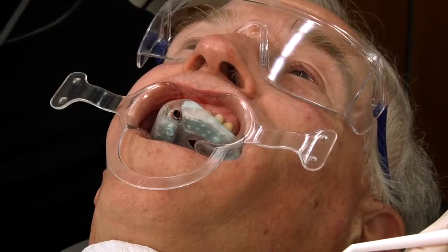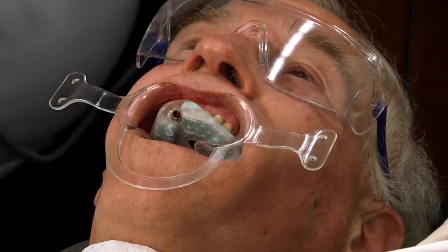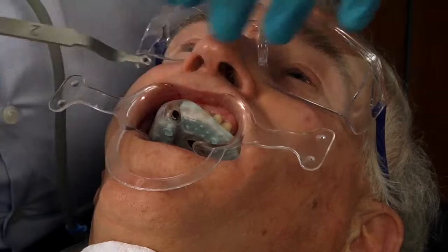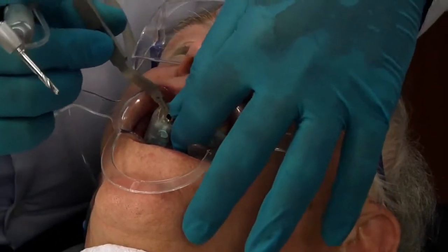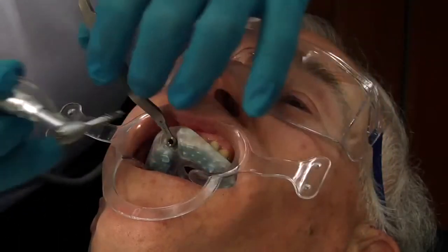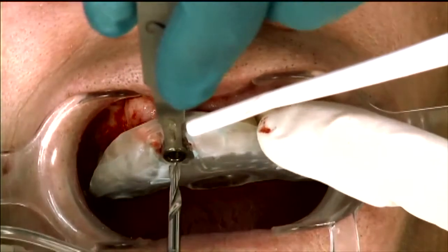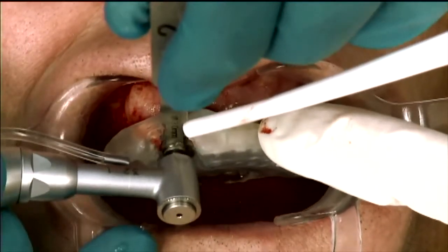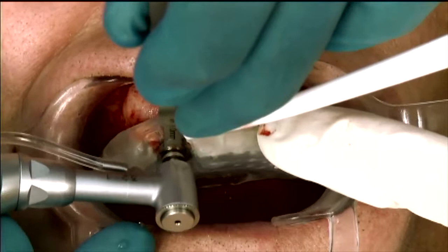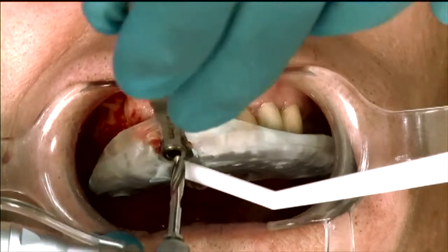The next handle says 3.0 C with handle number 2. So I'm going to bring in handle number 2 — there's the 3.0 end. It's going to go into the master cylinder. We've got it placed completely and we have a 3.0 C drill. We'll place it all the way in to depth and bury it a few times, and we're done with that.